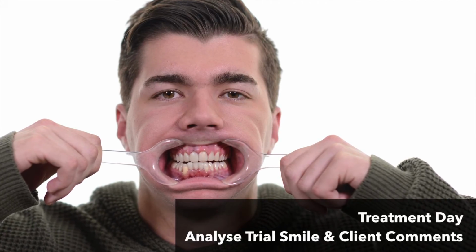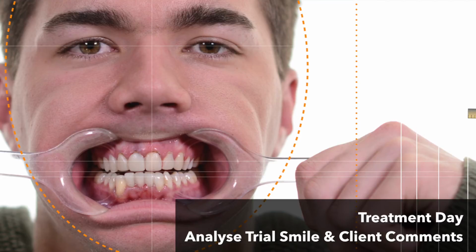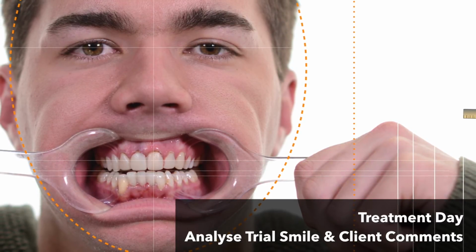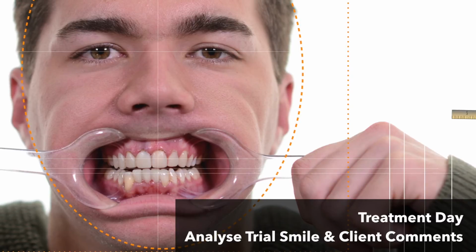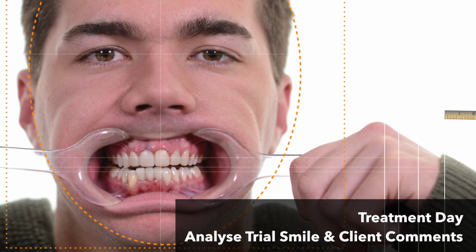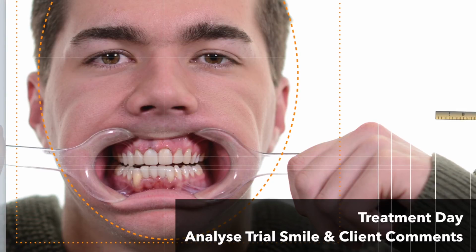We then are going to reanalyze this trial smile, of course, so we're using cheek retractors here to get him to pull his lips out, and then we're going to do digital smile design again on this trial smile. This is now probably our third reanalysis of the smile. Again, the idea is if we can analyze each step over and over again, we can make subtle improvements in order to ensure that the end result is as perfect as we can get it.